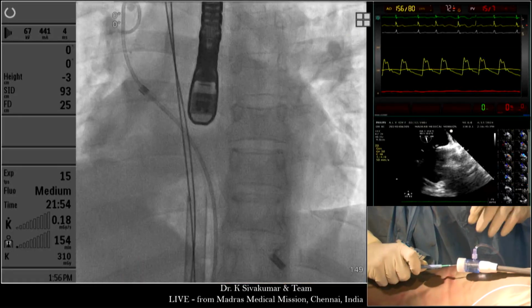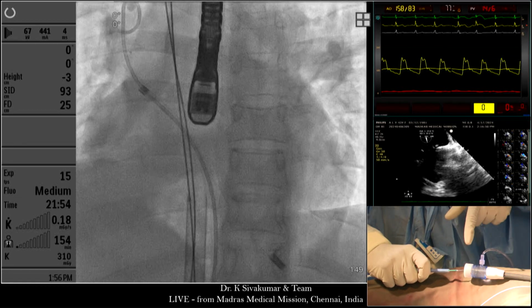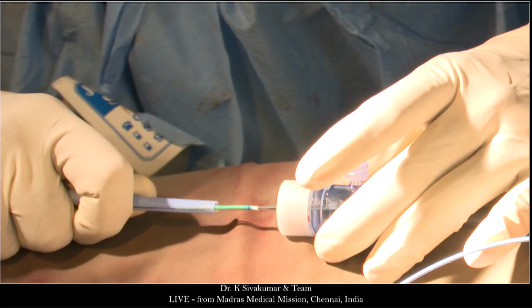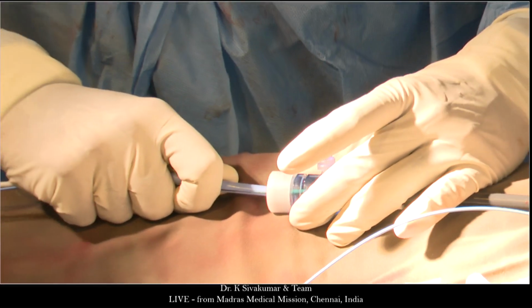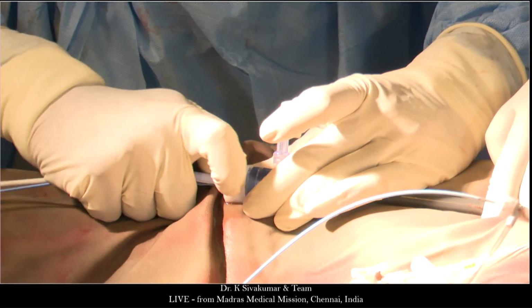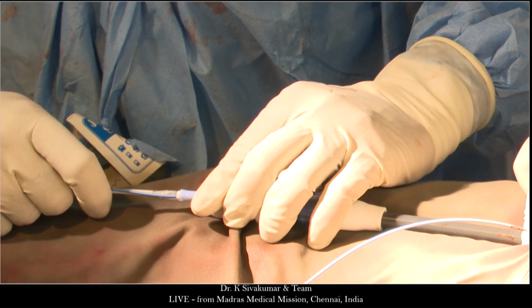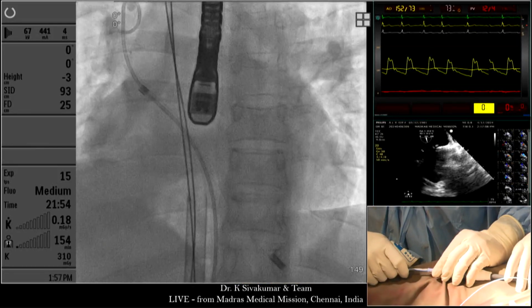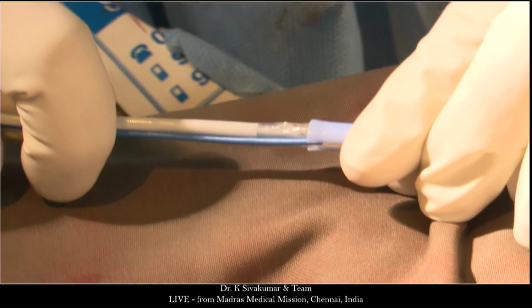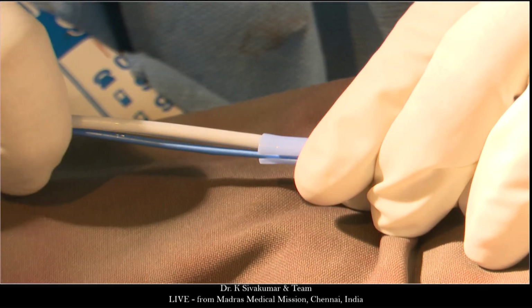So now you see that I am taking this combo protected by the sleeve through this valve, make this larger. We don't need fluid. So now I'm going to go inside. So at this position, I'm going to advance this assembly. Show the camera only. Yeah, we see it. So I'm advancing the total assembly.